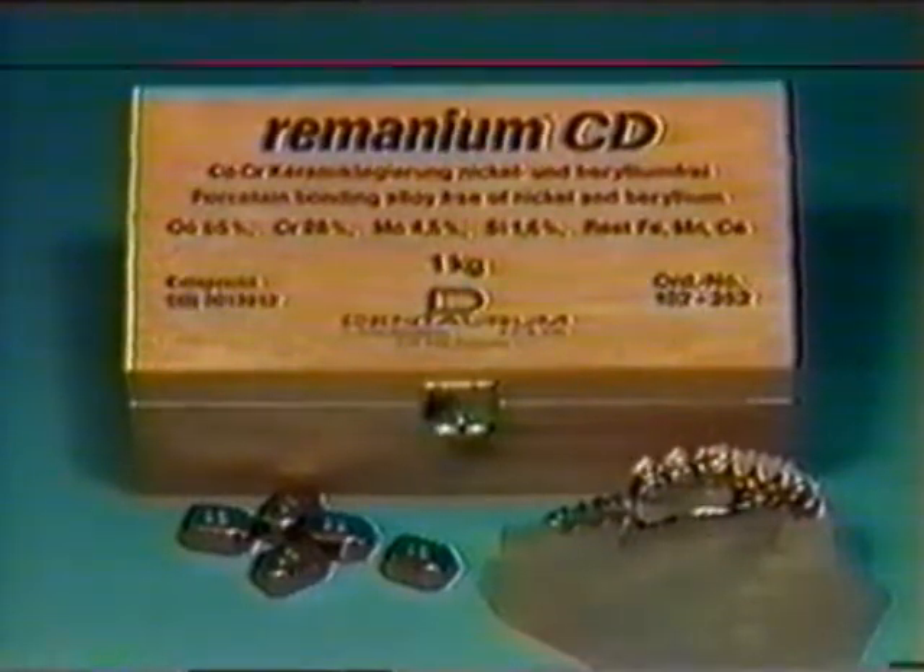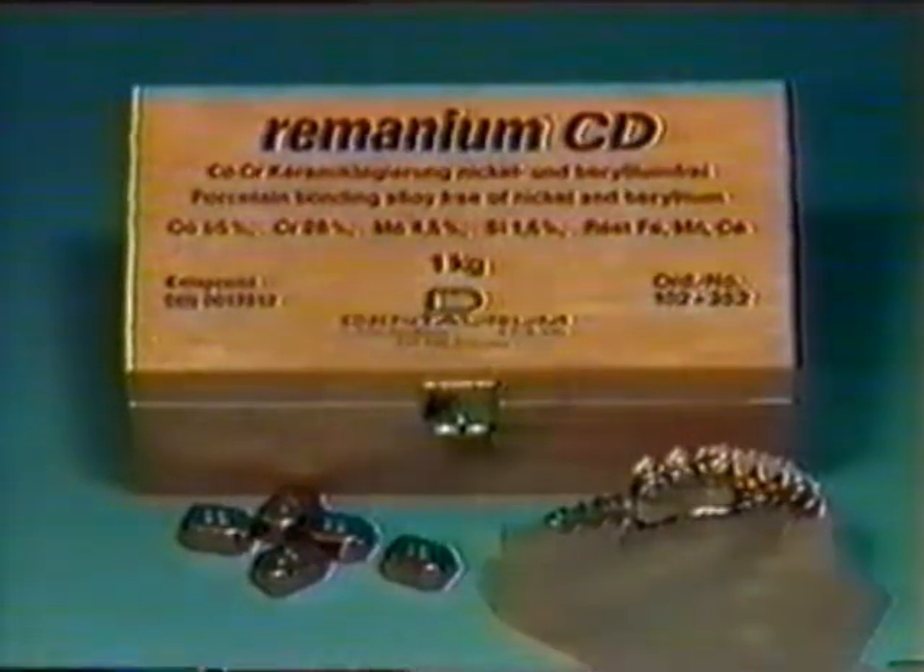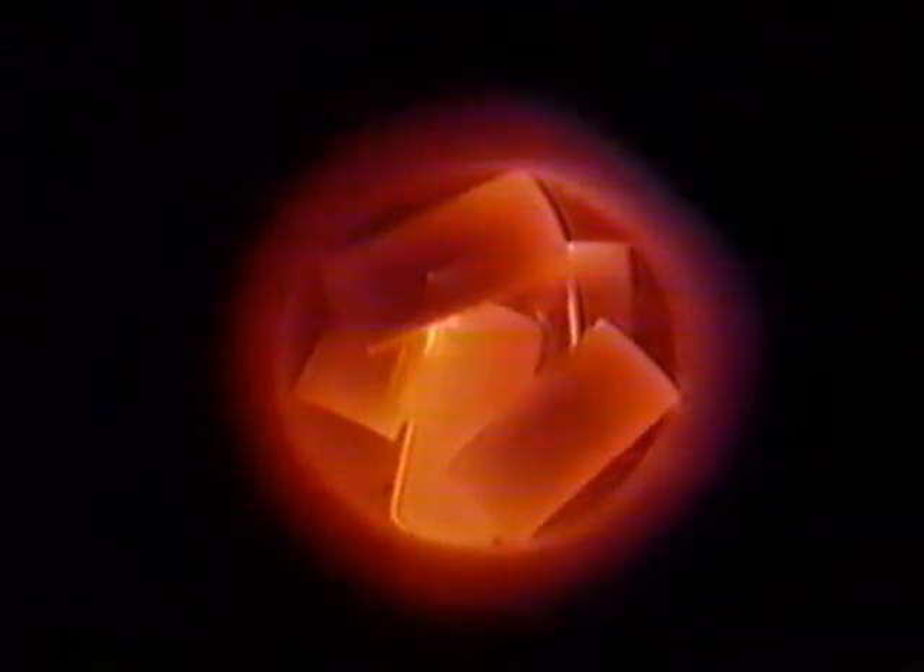If porcelain is to be bonded to the secondary structure, it may be cast with Ramanium CD, the chrome-cobalt porcelain bonding alloy. Ramanium GM380 can be melted in the high-frequency centrifuge. Heat until the individual ingots fuse and the last shadow has disappeared from the surface — this is the correct moment to release the centrifuge.